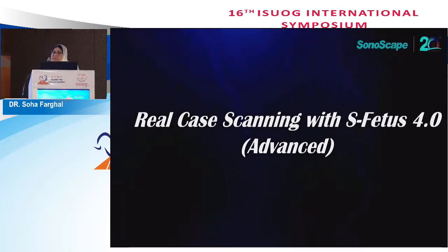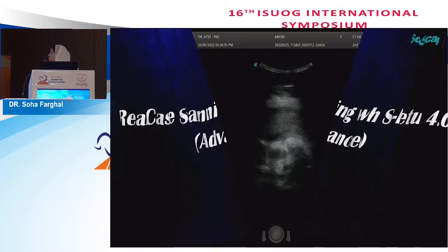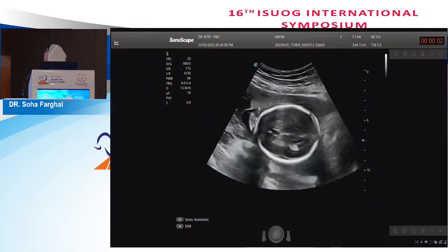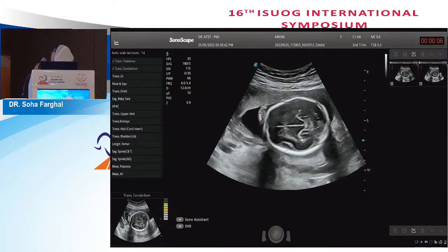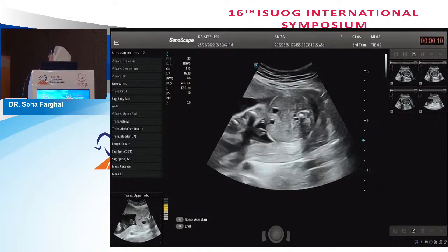This is a real case which is using the scanning to show you what is the time exactly when you do all these 16 planes using the S-Fetus form. The counter on the upper right hand side is showing the timing of this scan.